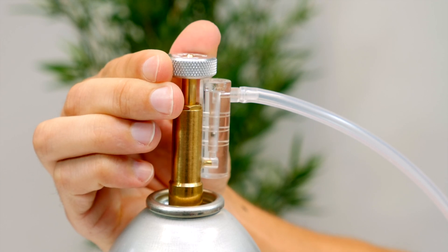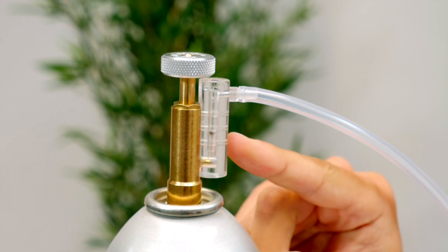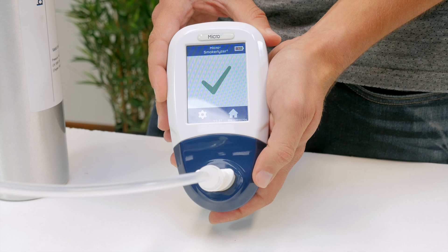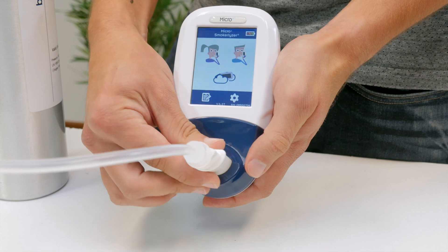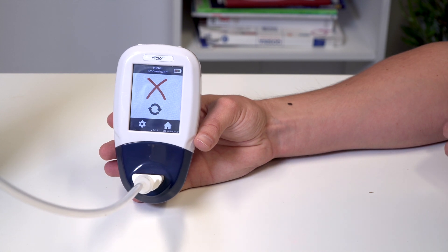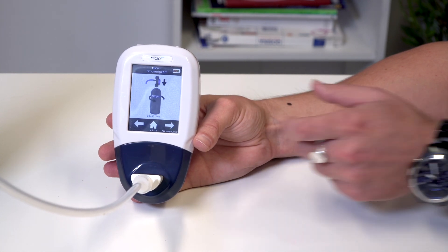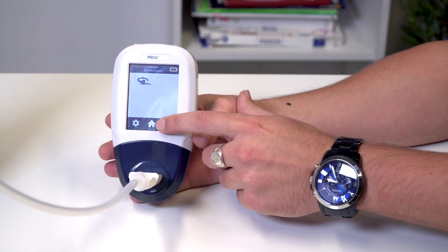Gas flow should be set to one litre per minute. A successful calibration will be indicated by a green tick — press the home icon to return to the home screen. A failed calibration will be indicated by a red cross. Press the retry icon to re-attempt calibration. If the problem persists, see troubleshooting or call your local supplier of Bedfont products.